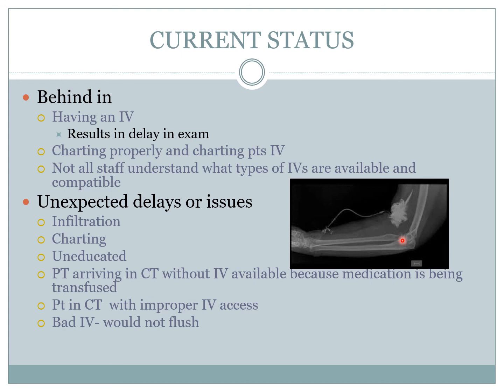And this was because the nurse was just using her arms, both arms. She wasn't going anywhere else but her arms. And it's kind of scary when they don't know that they can go anywhere else.